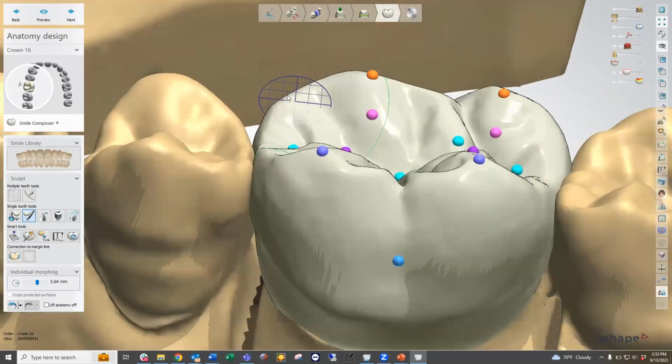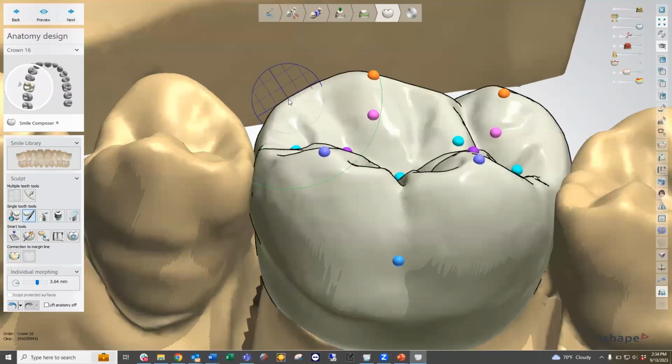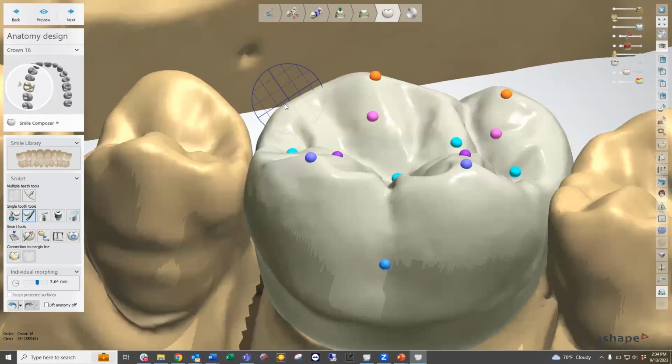Also, if we go to the outside edge, you can see that the tooth becomes emboldened with this black line. That indicates that we're going to be morphing along a silhouette, which means we're changing not just this edge, but every edge beyond it. So it's actually changing this whole profile of the tooth. And so to grab that whole profile, we can grab that silhouette and make that change accordingly.